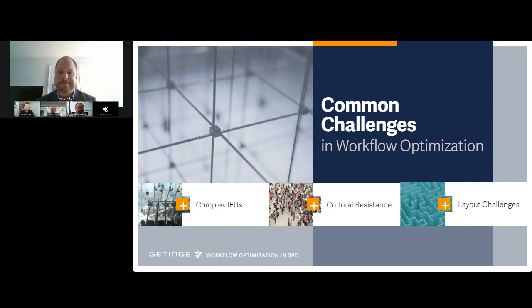I said, I'll tell you what, I'm going to take your tray, and I'm going to type out the IFU, which is the instructions for use, and I'm going to send it to you. And he said, yes, please do. And so I broke it down, start to finish. And I believe it came out to about 4.5 hours was the total time for this one tray. And I sent it to him. He turned around and put that in every OR and sent it to every nurse manager and said, if there's ever a question of how long it takes to do a tray, refer to that document right there.